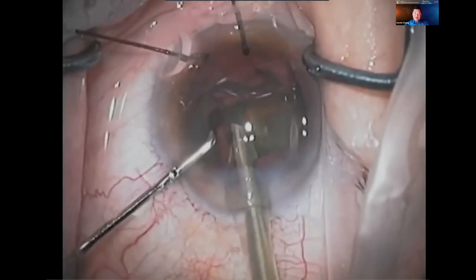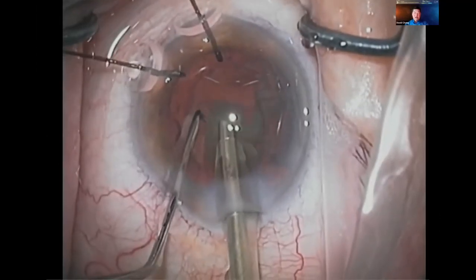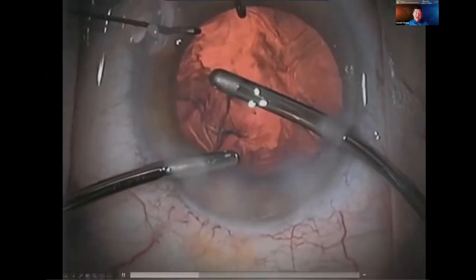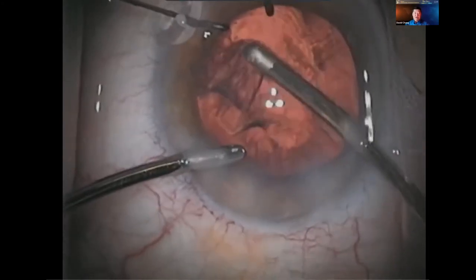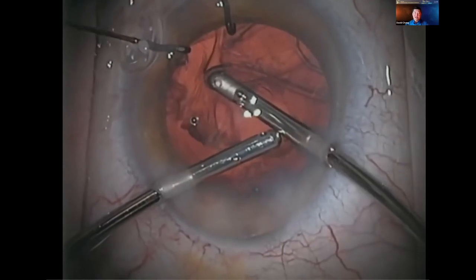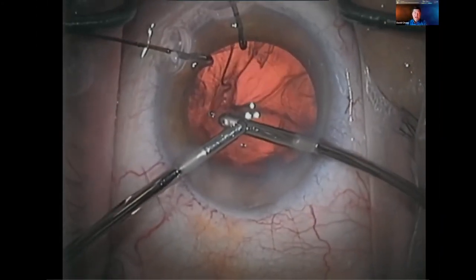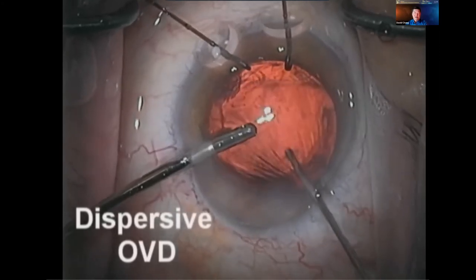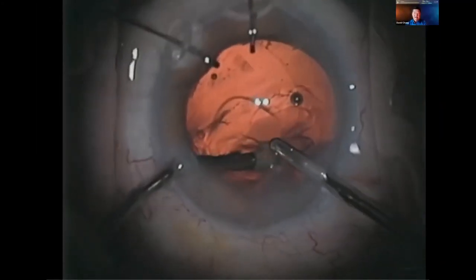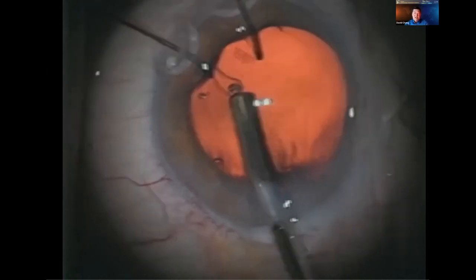Here's a pearl: I'm protecting my FACO tip with the chopper, but even so I aspirate the posterior capsule causing a small rent. What I needed to recognize is that even with just one piece remaining, the capsular bag is floppy — it's not taut because there's not enough peripheral pull from the zonules. So I use a dispersive viscoelastic that stays where I put it — I'm filling the capsular bag so it's on stretch. Once it's on stretch, it won't jump up to the FACO tip. With capsule retractors in, rather than pulling the last piece out, I push it back and put it on stretch with a dispersive — you can see how it stays there.